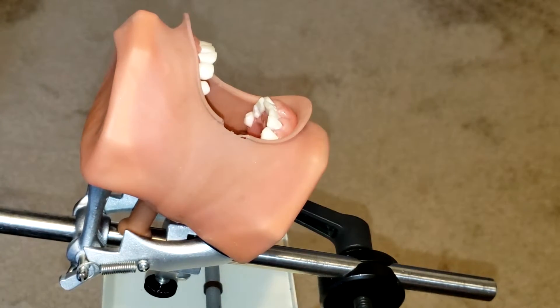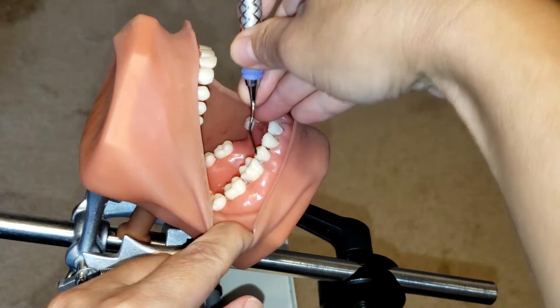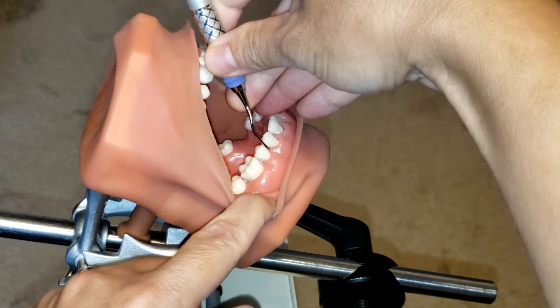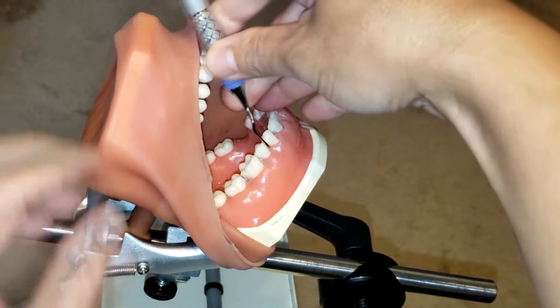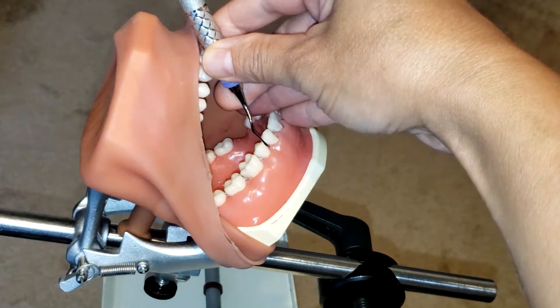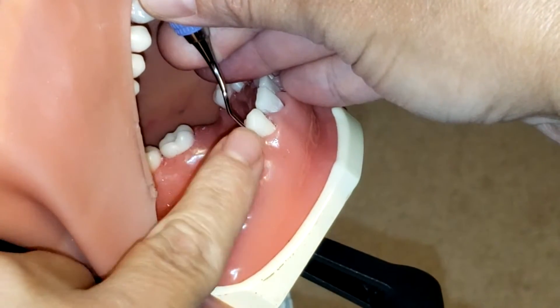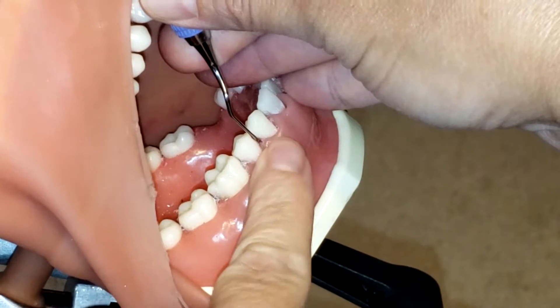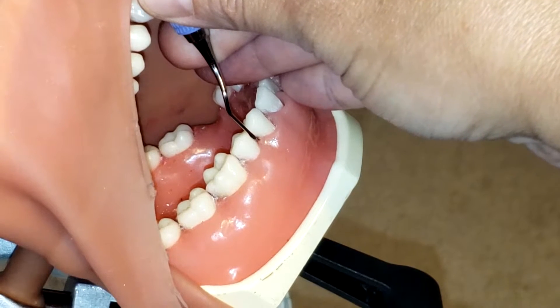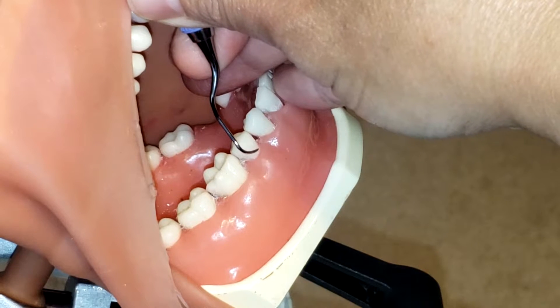First and foremost, we need to establish the correct working end. To do so, we place the instrument approximately between the two premolars. You can see that the lower shank is parallel to the long axis of the tooth and it creates a V at the distal of that first premolar — a V to the D. That is how you know that is the correct working end.